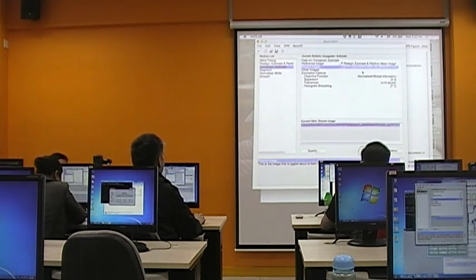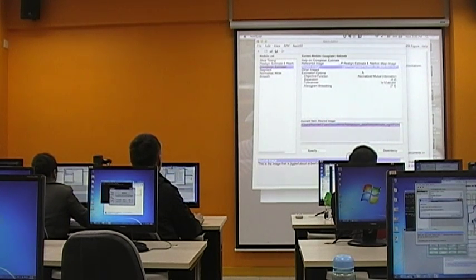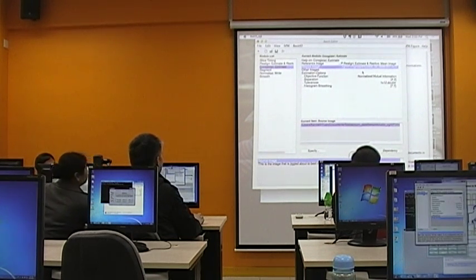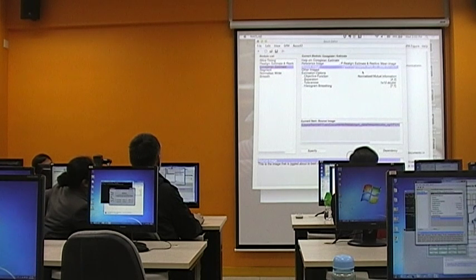So you're minimizing the paradigm-induced fluctuation in terms of the signals in this case. Anyway, you also have the T1, the structural image, and these two sets of images are supposedly in the same space, having the same orientation, so they are in the exact same location in the view of the computer.